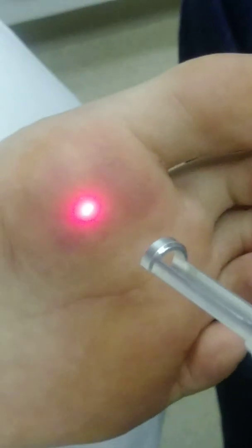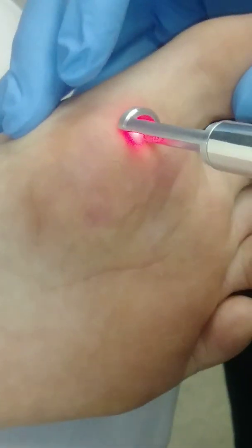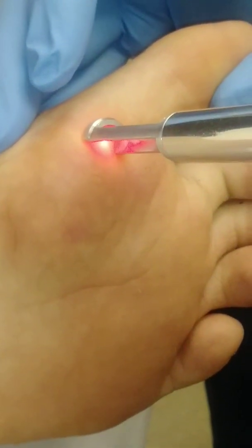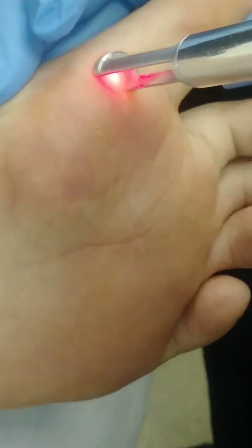We have other types of lasers we use for different things. This particular laser is used more for cosmetic things, such as fungus nails, which is what we use it for pretty much every day, but also it can be used to remove tattoos, for hair removal, and some other things that we typically don't do on the foot.